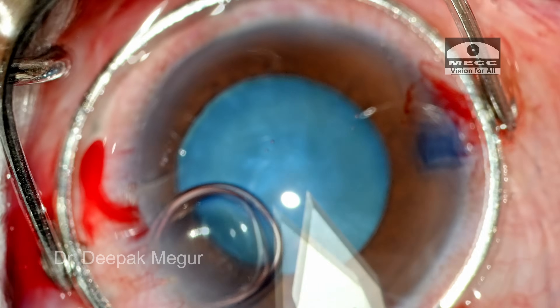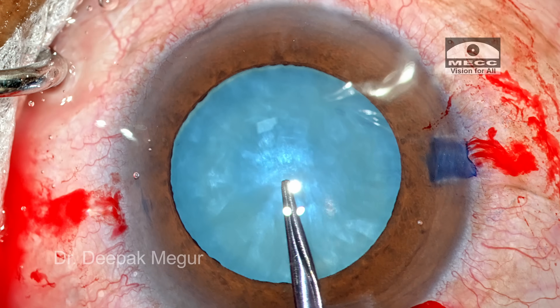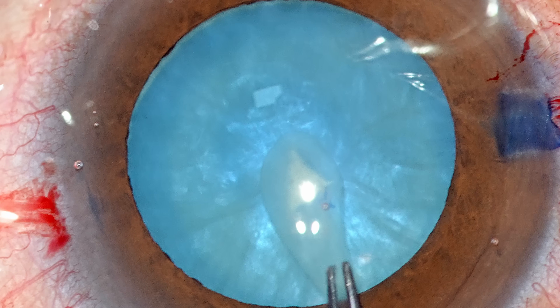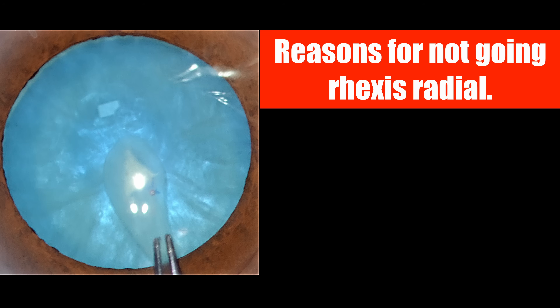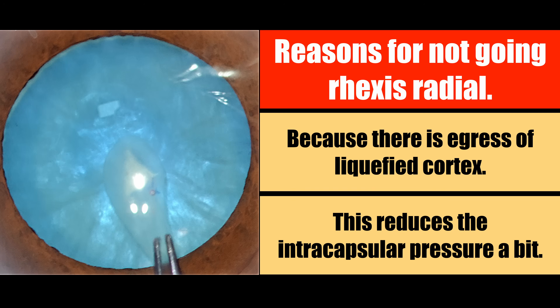The main 2.8 mm entry is done and now is the time to perform the rhexis. The first triggering factor: the puncture is not so smooth — it is slightly more jerky. We have a cruciate tear now and fortunately it has not run away. One of the reasons why it has not run away is because there is some egress of the liquefied cortex out, which reduces the intracapsular pressure a bit.